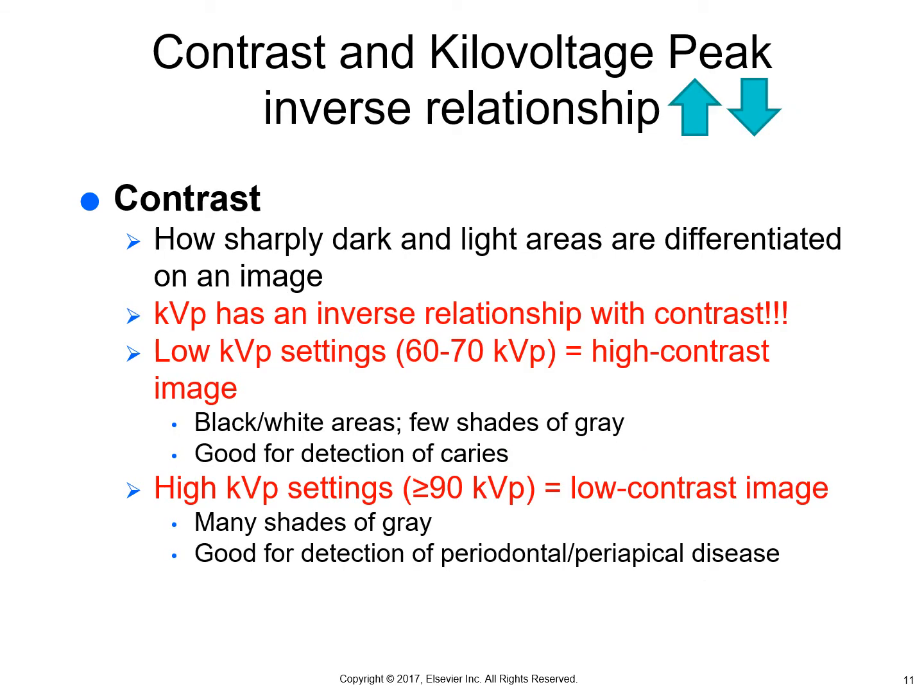Contrast and kVp. I wish I were standing in front of you, because students tell me when they go to boards they picture me with one thumb up and one thumb down. For kVp, always picture me with a thumb up and a thumb down. If I increase kVp, I'm going to decrease contrast. It has an inverse relationship, and the opposite is also true. If I decrease kVp, I'm going to have higher contrast.